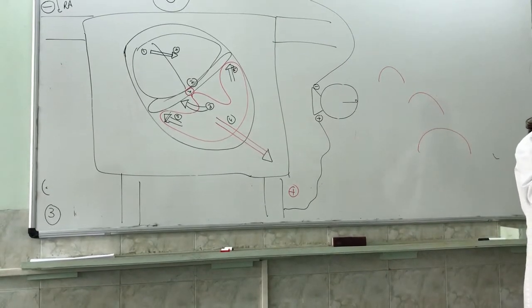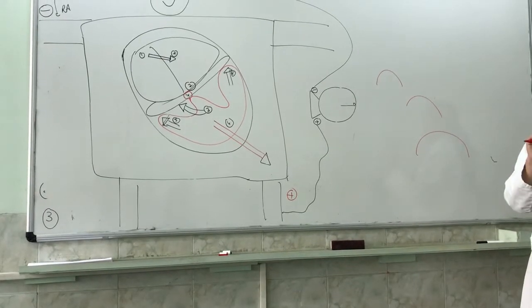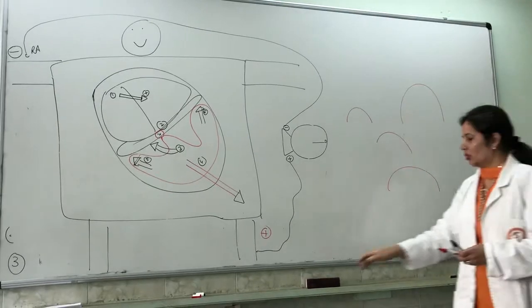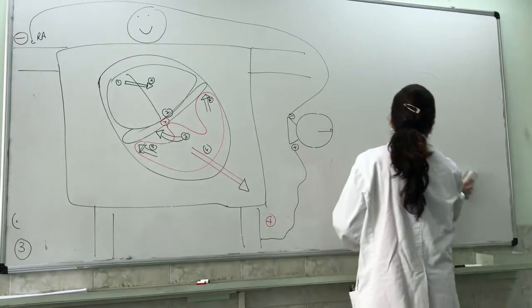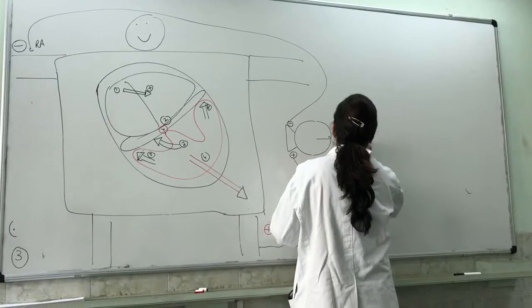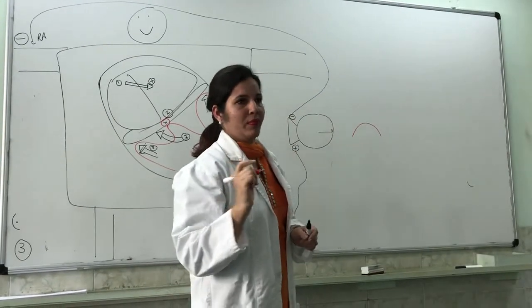Moderate velocity, right? So your strength of vector should be moderate. You can make it like this also, right? So first of all, the first wave, which is due to the atrial depolarization, the positive charge is going towards the positive electrode. The first wave is the P wave of moderate velocity. Clear?